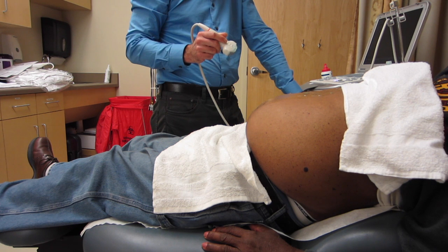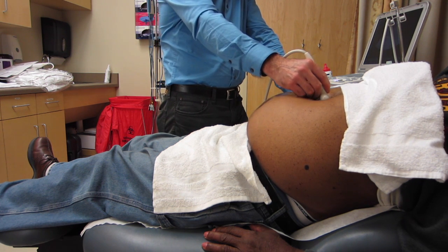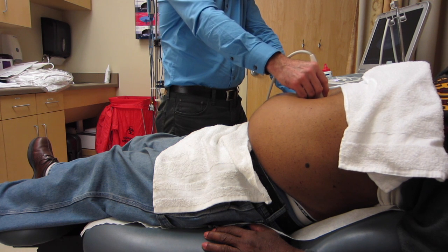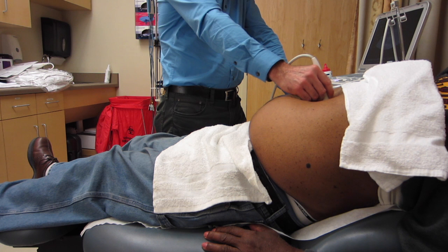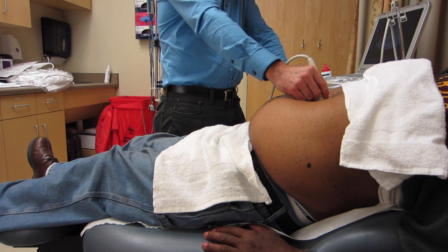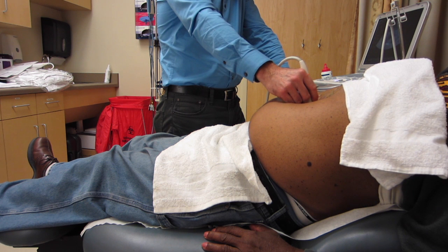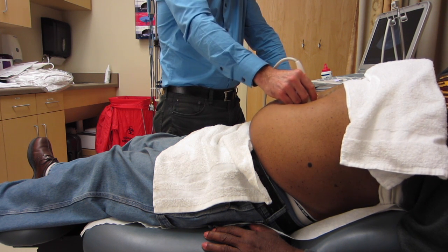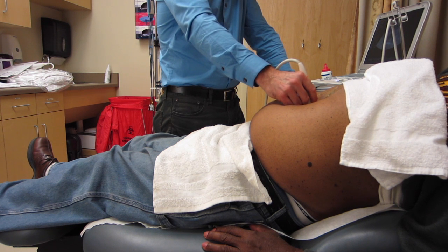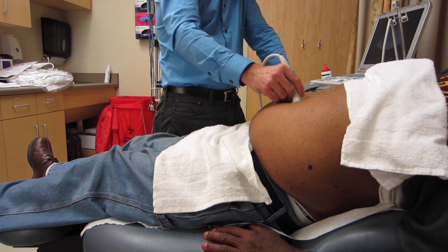If bowel gas is noted in the upper aorta, you can ask the patient to take a deep breath and hold to try to displace the gas. If gas is noted lower down, apply firm pressure for 10 seconds to try to displace the gas. If this does not work, then release the pressure and reapply if needed.